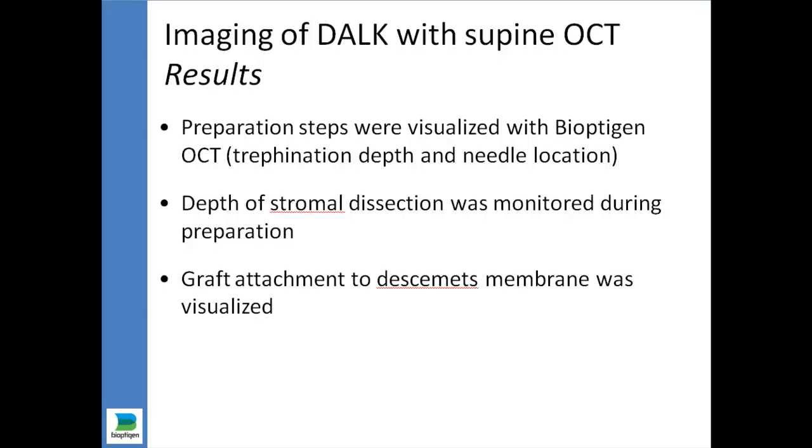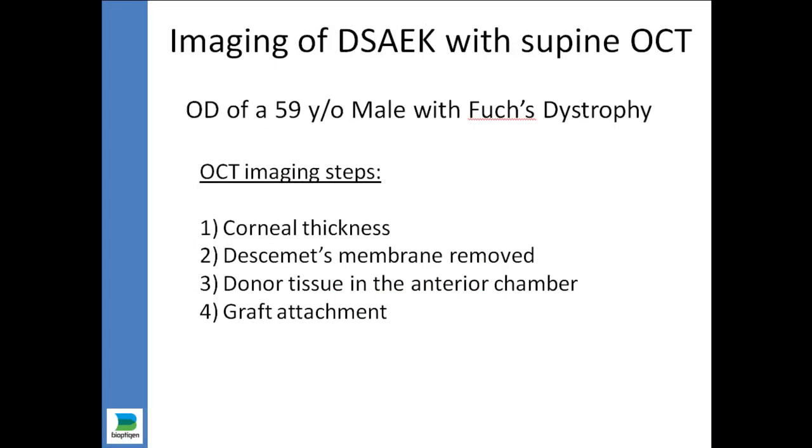How about DSEK? DSEK surgery, again, as I mentioned, is a common procedure for endothelial cell replacement. And one of the problems with DSEK surgery, and one of the most common complications that we see, is graft detachment postoperatively. So how can we make this procedure better and minimize that complication?